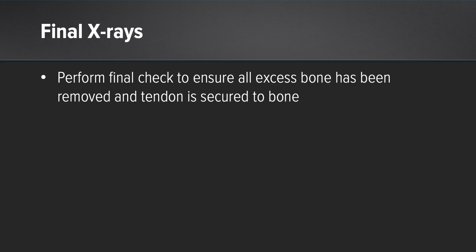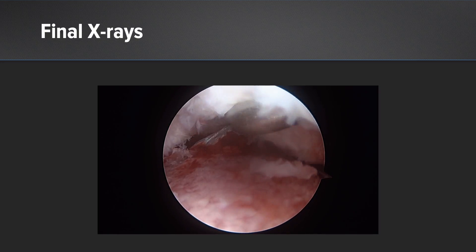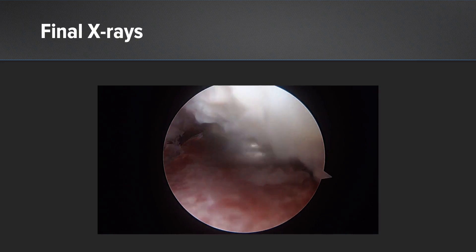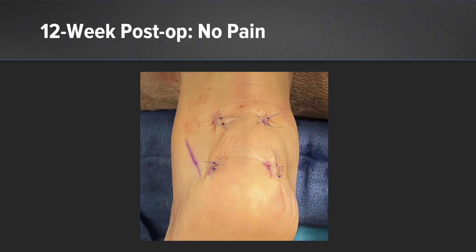You then get an x-ray that looks very much like what we perform with an open view. Your final check ensures that all the excess bone has been removed and that the tendon is secured to the bone — you can check this either fluoroscopically or through the scope. You can see I've not left any debris back there. And what's really cool is the incisions you make are so small that even in this diabetic patient at 12 weeks post-op, you can see the incredible healing you get.